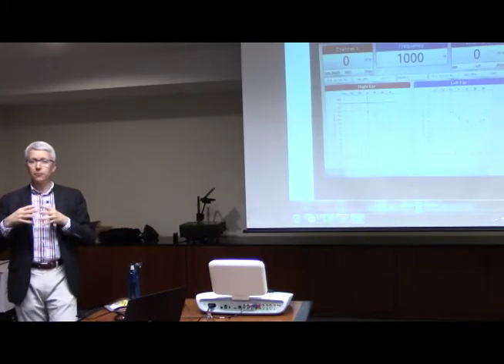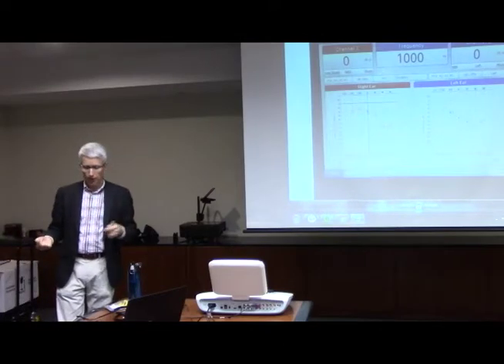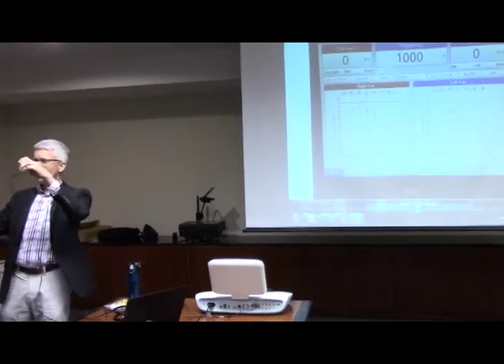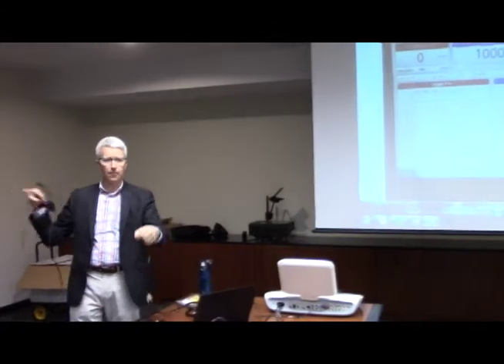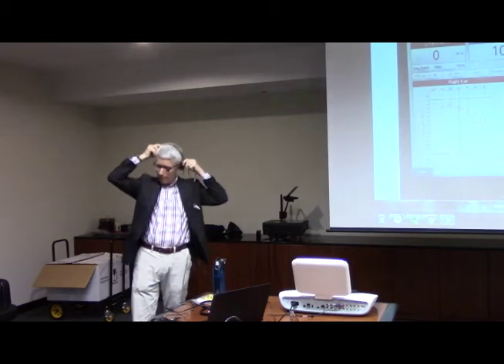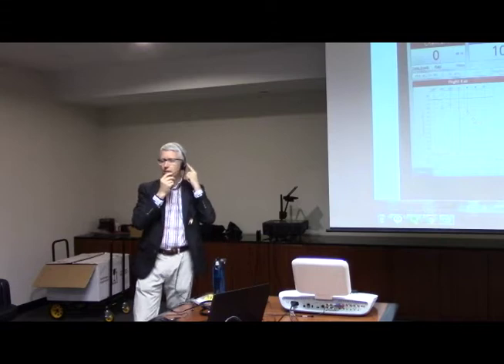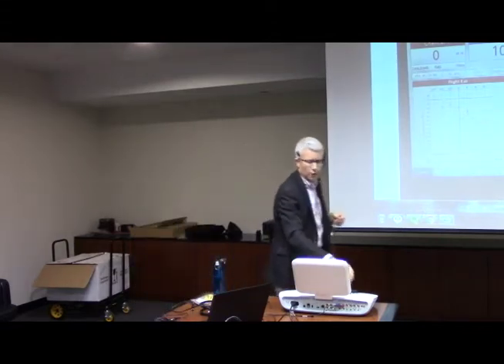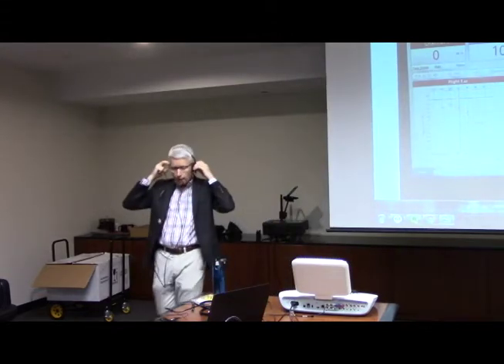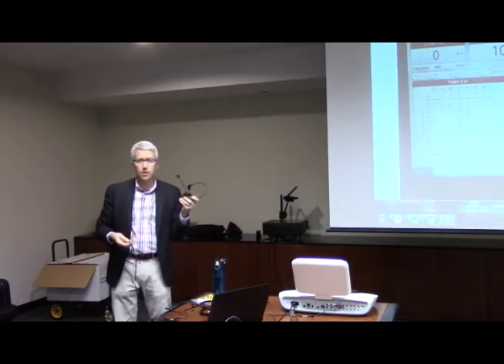When it comes to a full comprehensive hearing test, we also do what's called speech audiometry. So you have a mic monitor headset, which I'm sure many of you are either familiar with or have seen or come across on invoices and that kind of thing. So this is a mic monitor headset here that the audiologist or a tester would wear. Just real simple like this, microphone here. Right now when I'm pushing this button here, you're able to hear it through here. If I had this plugged in, I'd be hearing it through here instead of that. You all wouldn't be.